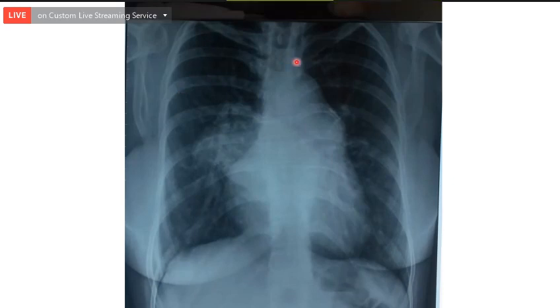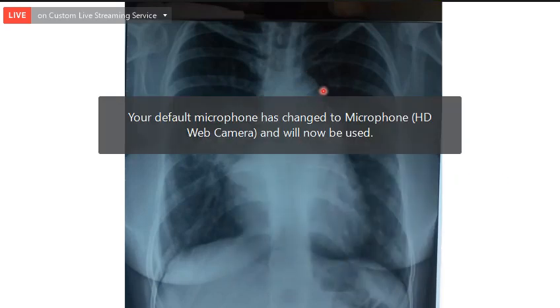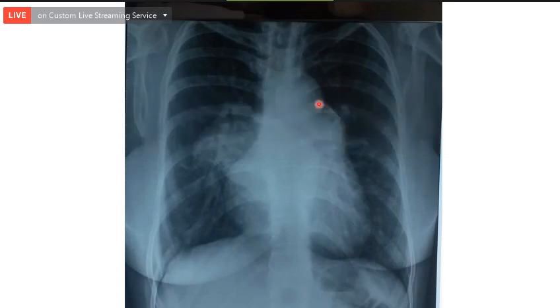Now, what about this one? What is this? Yes, sir. This is the X-ray of a 40-year-old female. What is that structure? Sir, aorta, sir. Aortic knuckle. Aortic knuckle. And is it prominent or is it normal, or is it enlarged? Enlarged, sir. Enlarged. Whenever the aortic knuckle is seen beyond the transverse process of the vertebra, then you should think that it is dilated. So here it seems to be dilated.